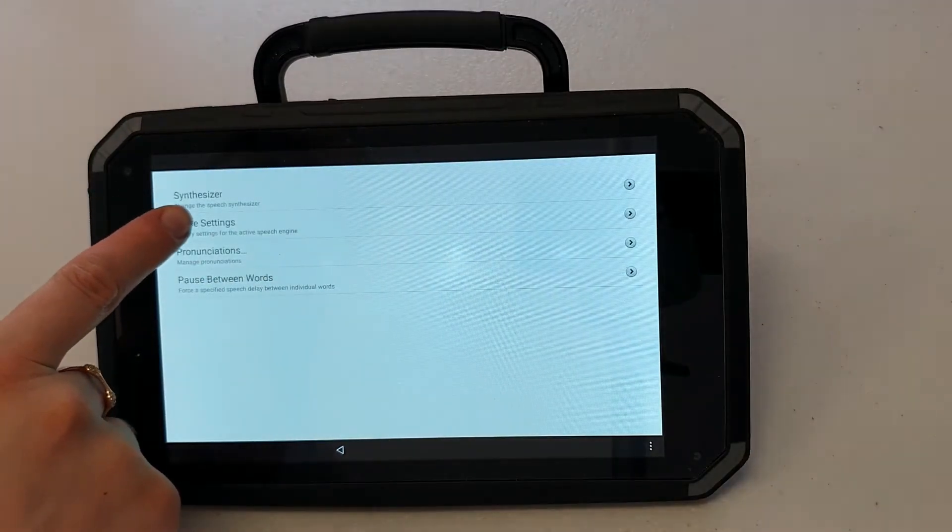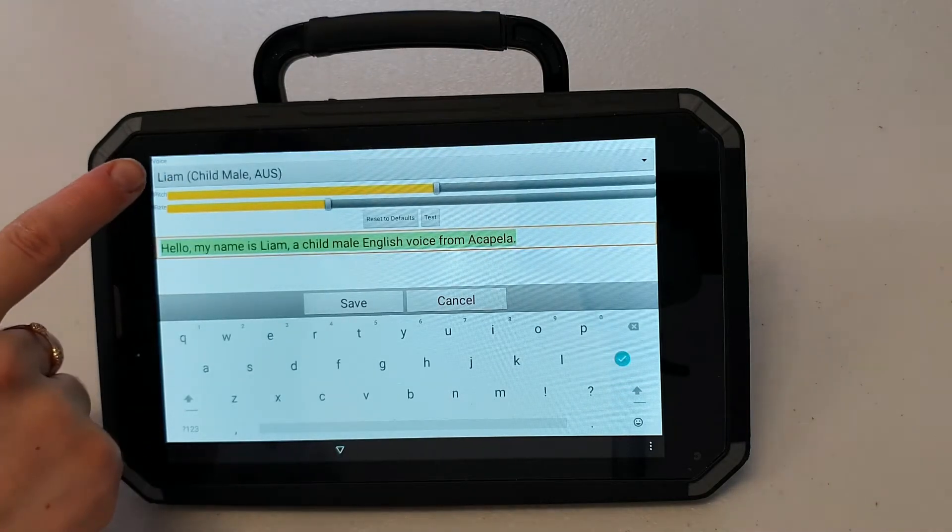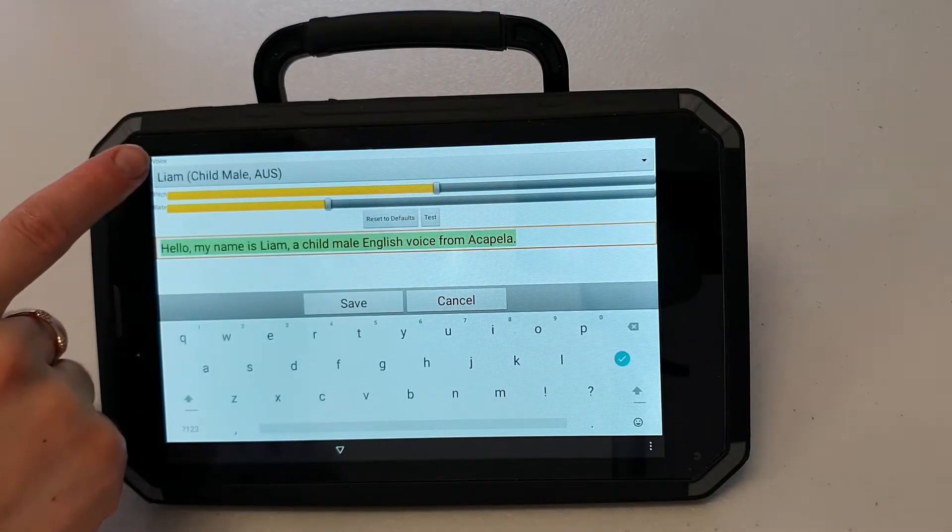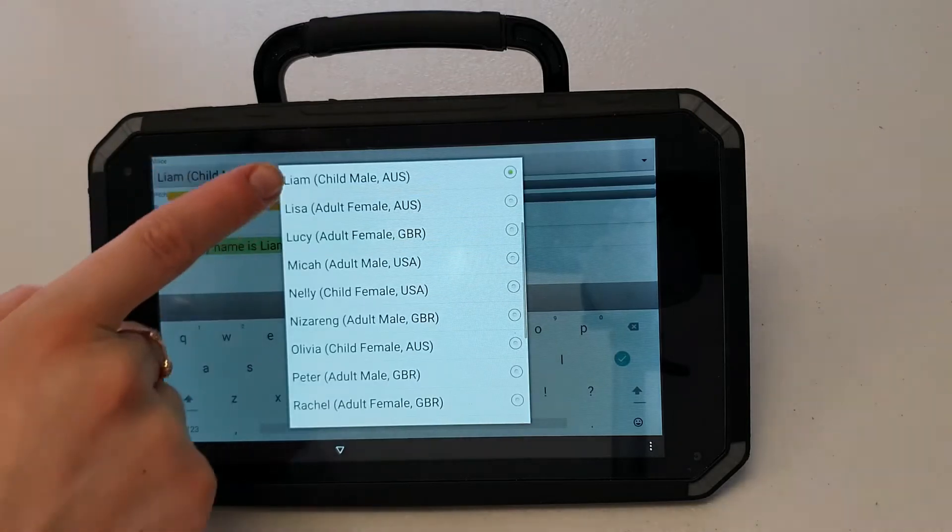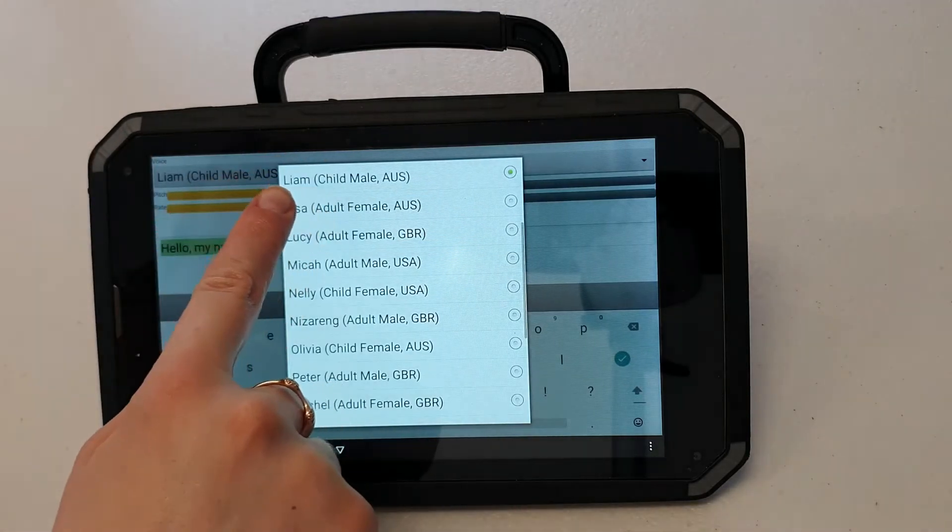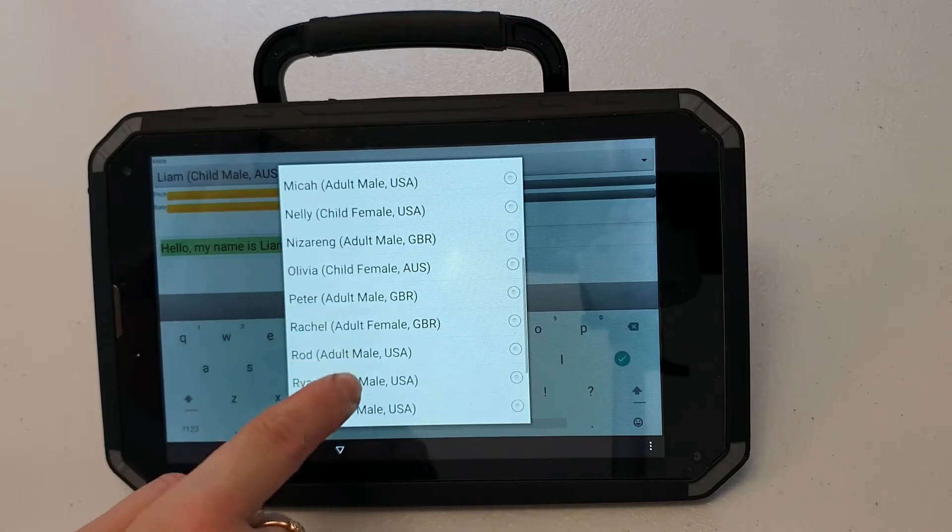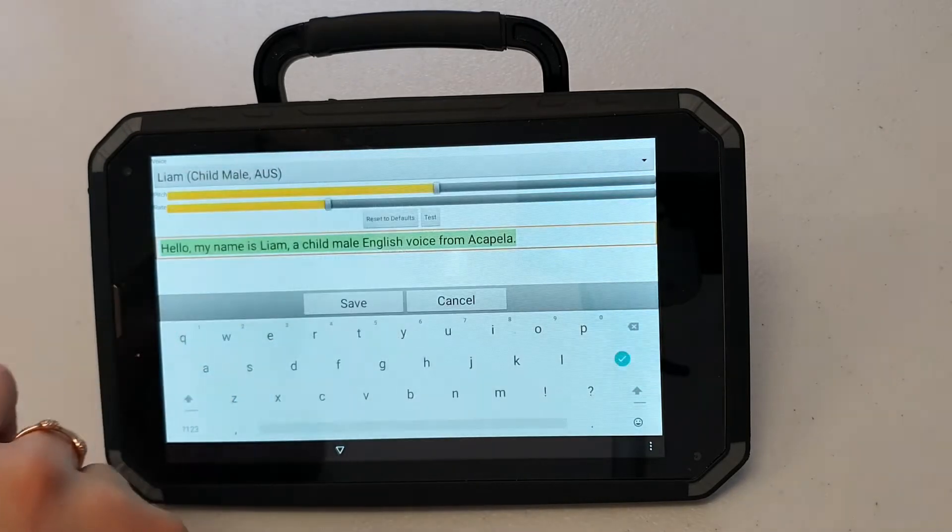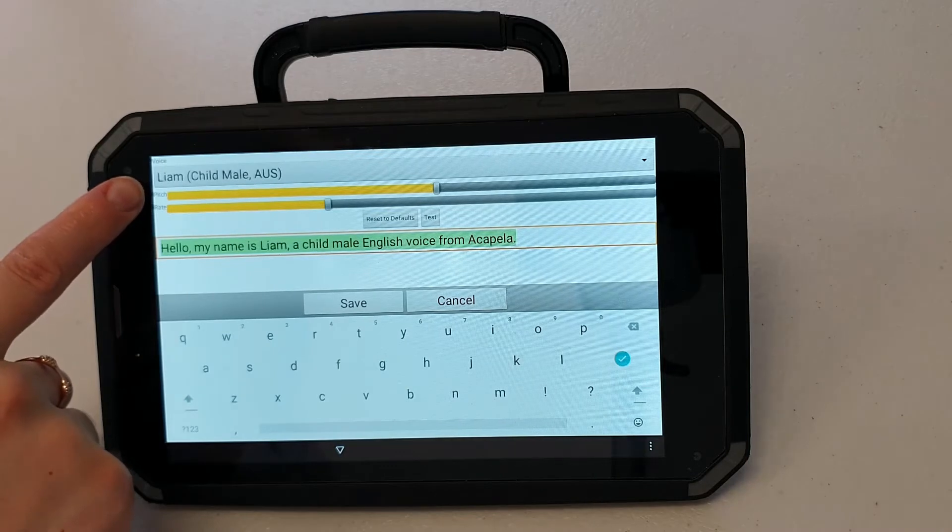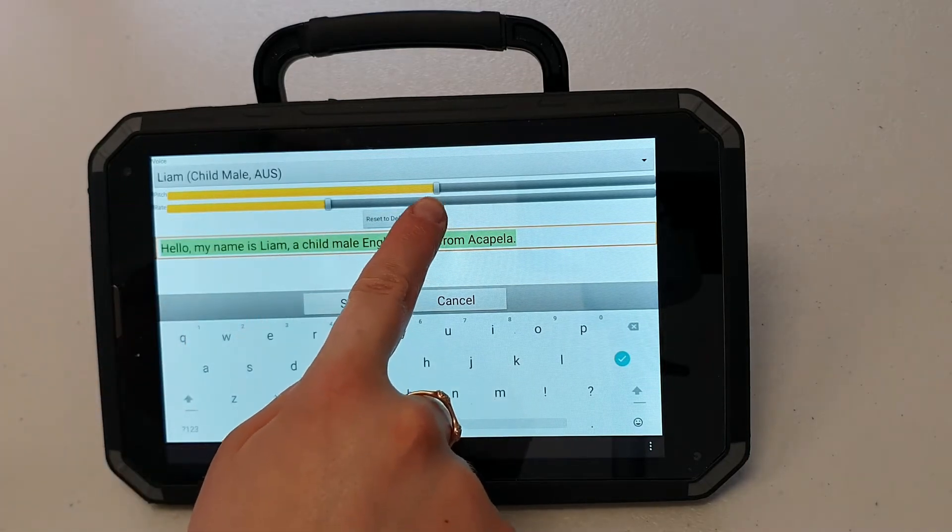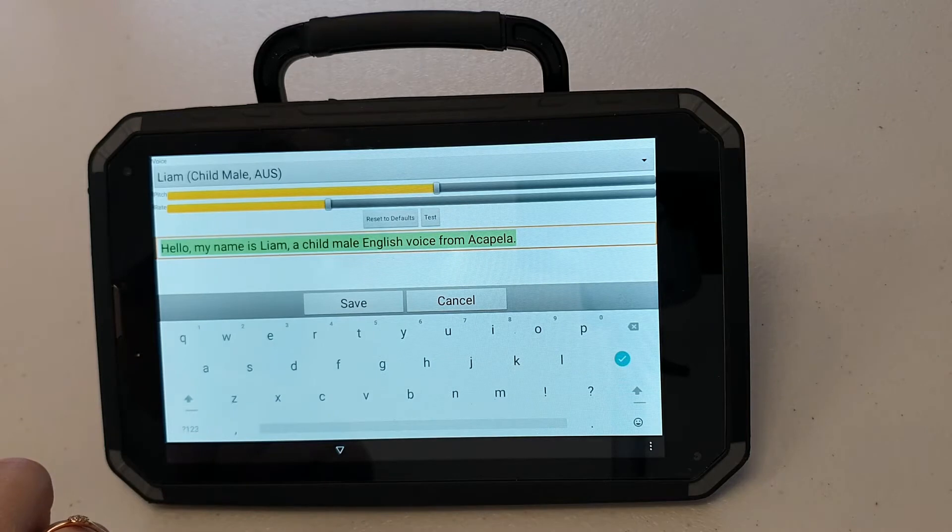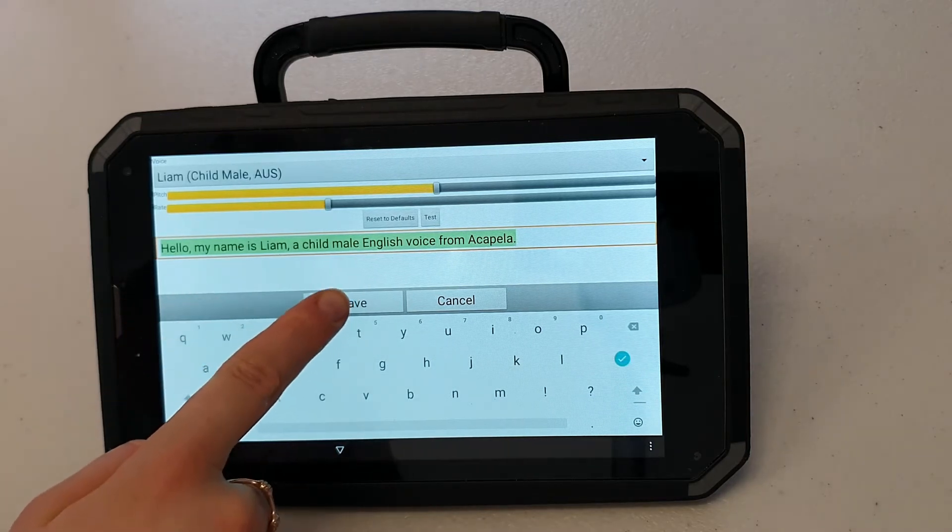Voice settings will give me the option to change between different Australian voices. You can see here you've got quite a few. Look for the name and the AUS acronym next to it. Once you finish changing the pitch and the rate you can test the voice. Hello my name is Liam, a child male English voice for Acapella. And then press save.